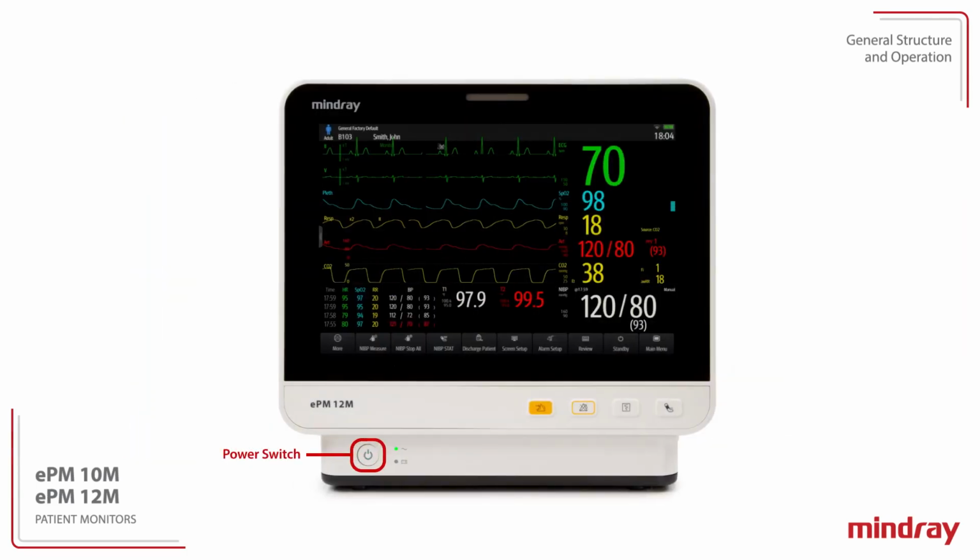The power switch is in the lower left corner of the ePM 10M and 12M patient monitors. Press the power switch to turn the monitor on. The power switch illuminates green when the monitor is on. To turn the monitor off, press and hold the power switch.